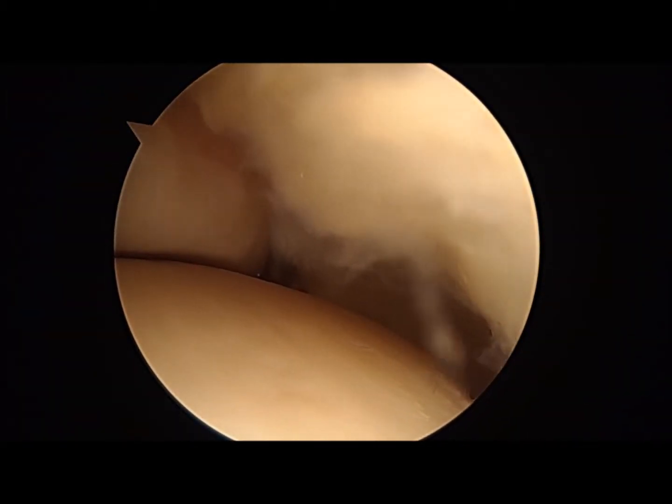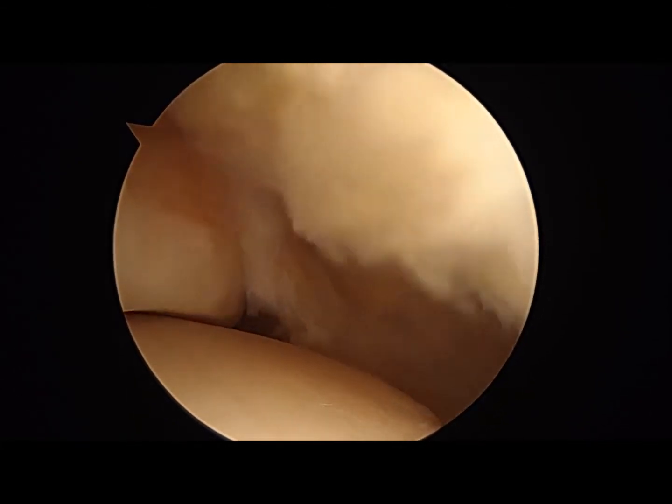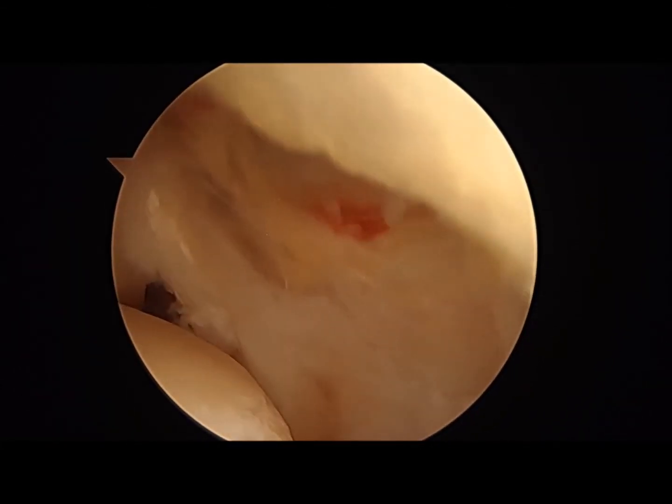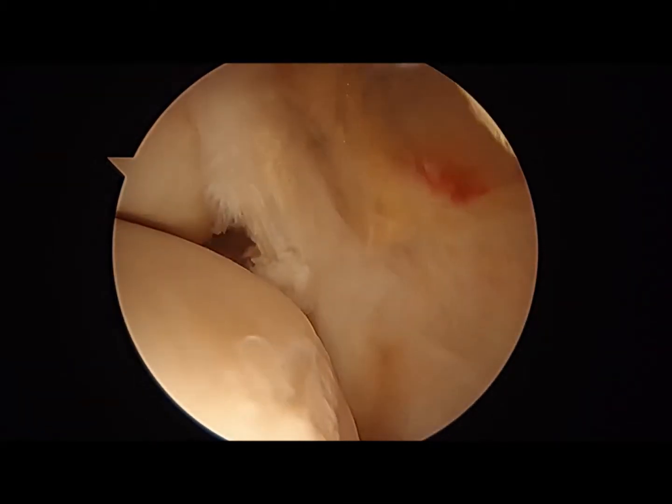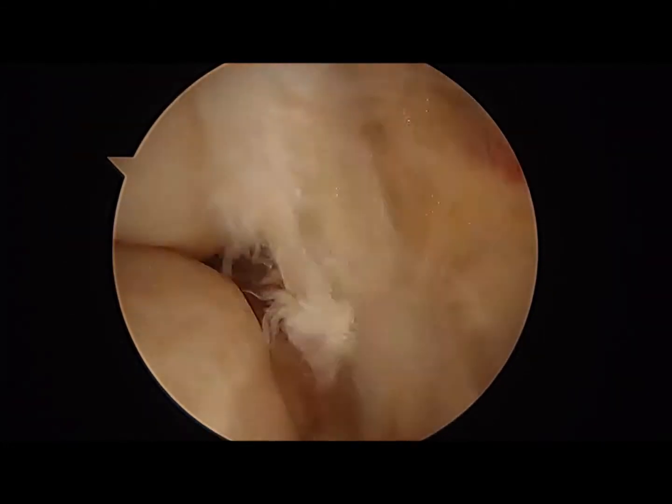So the anterolateral gutter looks to be clean. There's still a little bit more right here. I'm going to go get that soon. Go get that little piece right there on the side.